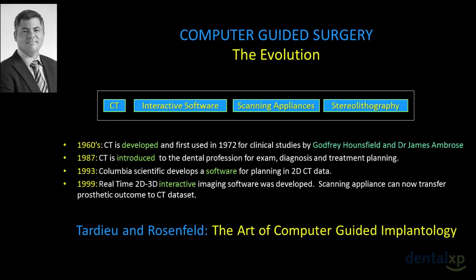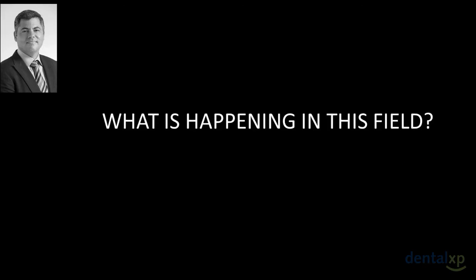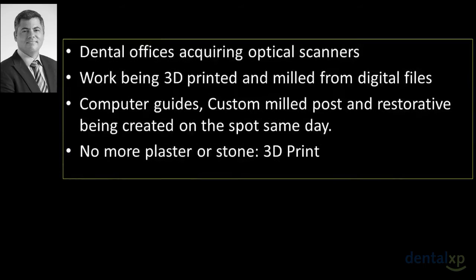This technology has been evolving and continues to evolve since the beginning of cone beam CT in the early 2000s. Dr. Albert Mattia and Michael Pikos refer to it as the most significant development since the work of Brånemark. And it is indeed, as implant dentistry protocols are being rewritten based on all the new advancements related to the fields of imaging, laser scanning, 3D milling, and printing that are making 3D implant dentistry a reality. The main advances related to computer-guided protocols are related to the ability to prepare most components and parts before the actual work is being done.